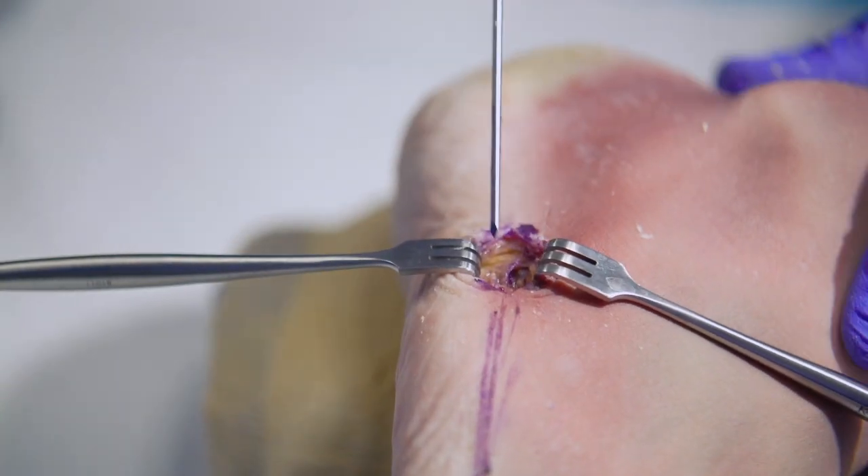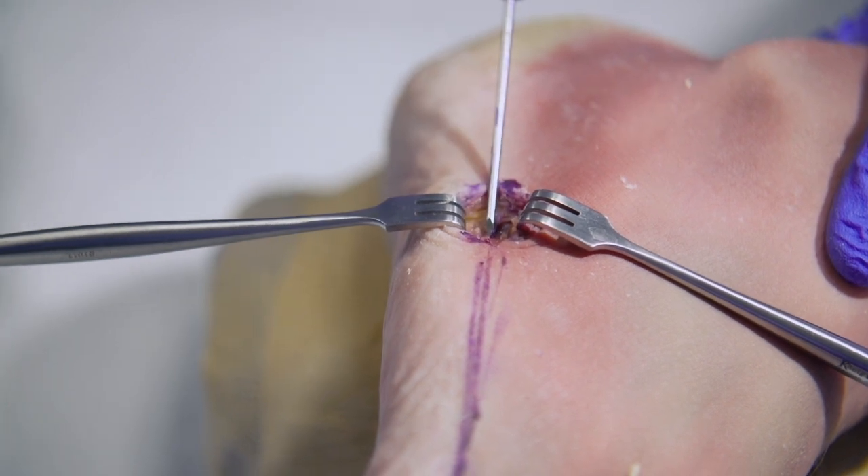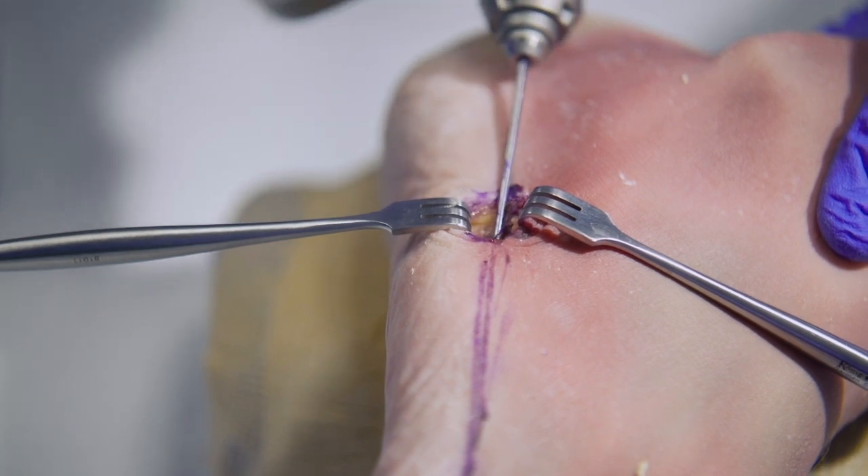So here we're opening up the fifth metatarsal cuboid joint. We utilize our previously placed line along the long shaft of the metatarsal to use that as a rough guide for placement.